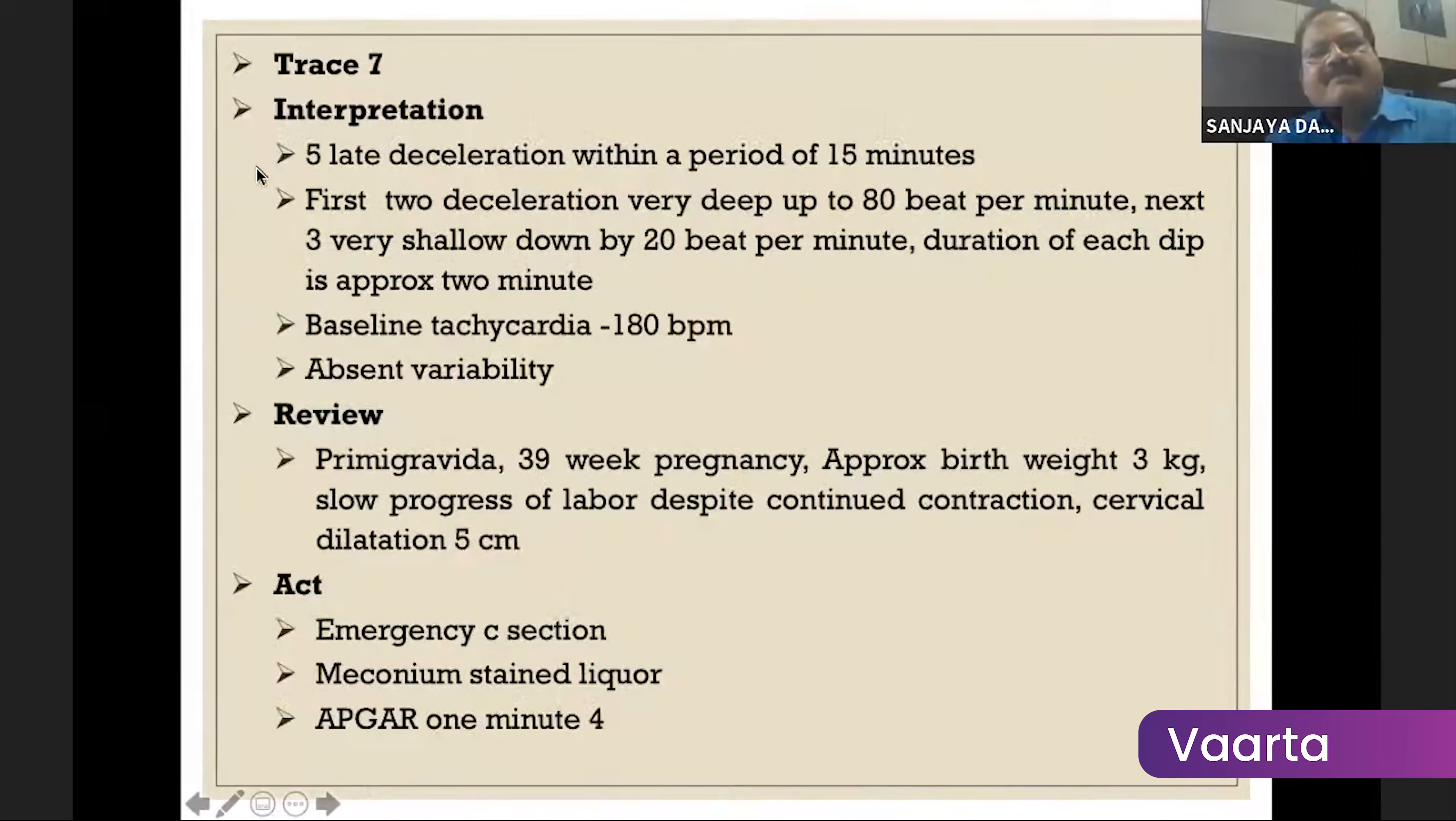This is a primigravida of 39 weeks and emergency c-section was done for meconium stained liquor with an APGAR score of four. You have rightly taken the decision.